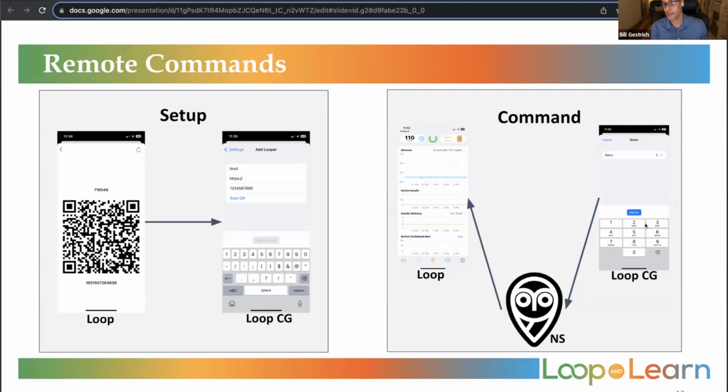And then Loop, because it has the QR image, is going to say, hey, does the code that was sent to me match my code that I calculate from the QR image? If it does, it'll let it go through. Otherwise, it will reject it. So that's the connection with the QR image. I think the number one thing is just the security. You don't want to ever lose that QR, or I should say, share that with someone you don't trust.